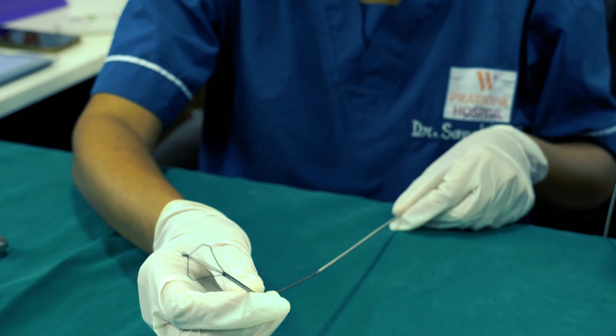We can see the tip of the dormia basket coming out through the suction port. For those kinds of foreign bodies which are difficult to evacuate through forceps, we just have to go to the other side, open up the dormia basket, catch hold of the foreign body gently, get a good grip, and so it can be removed easily.